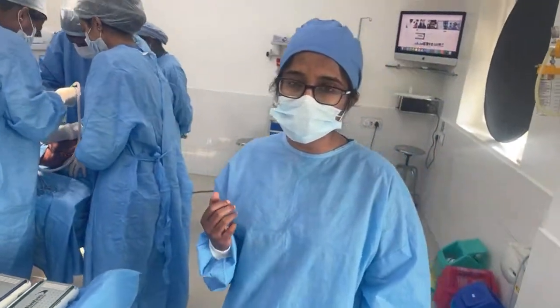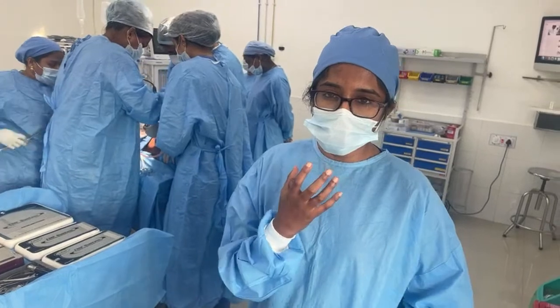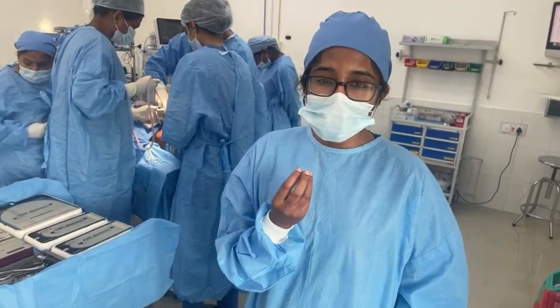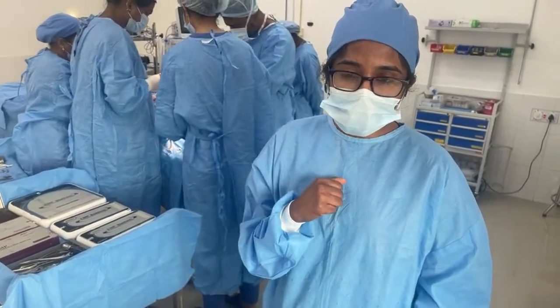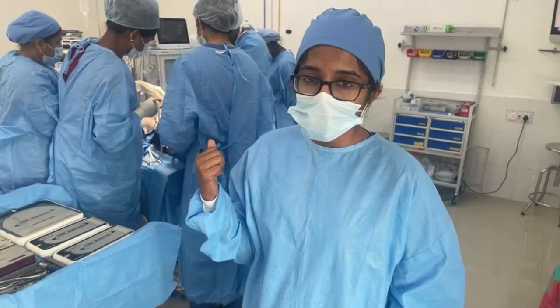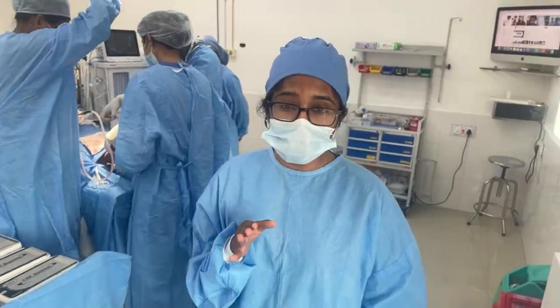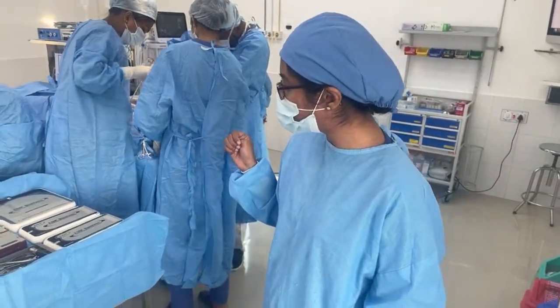This is teamwork because there is soft tissue around the bone, around the chin area, and the oral cavity itself is small. So we have to do a lot of retraction so that while Dr. Richardson is using the saw, none of the soft tissue area is injured. So a lot of retraction is needed.